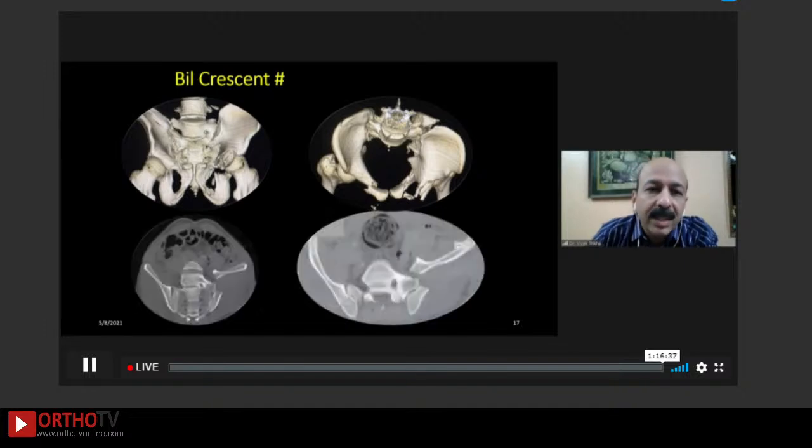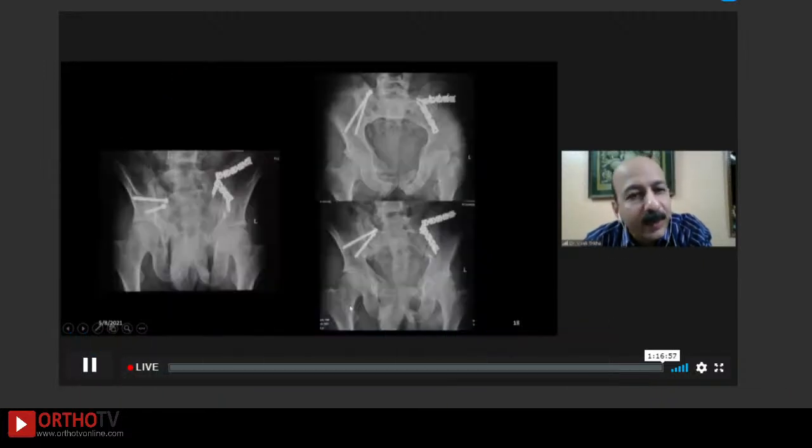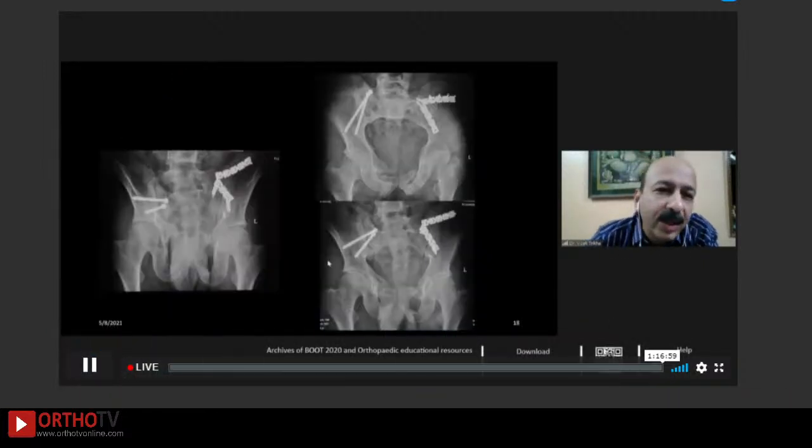If you see the CT scan, the 2D scan as well, you will see that it is having an undisplaced sacroiliac on the opposite side present, the standard normal crescent on one side, and this sort of a crescent on the other side, which is a type 1, type 2 sort of a fracture. And here it is the normal crescent. We went about the same way. The LC2 screws were put percutaneously afterwards while putting in a prone position, while these were put anteriorly.